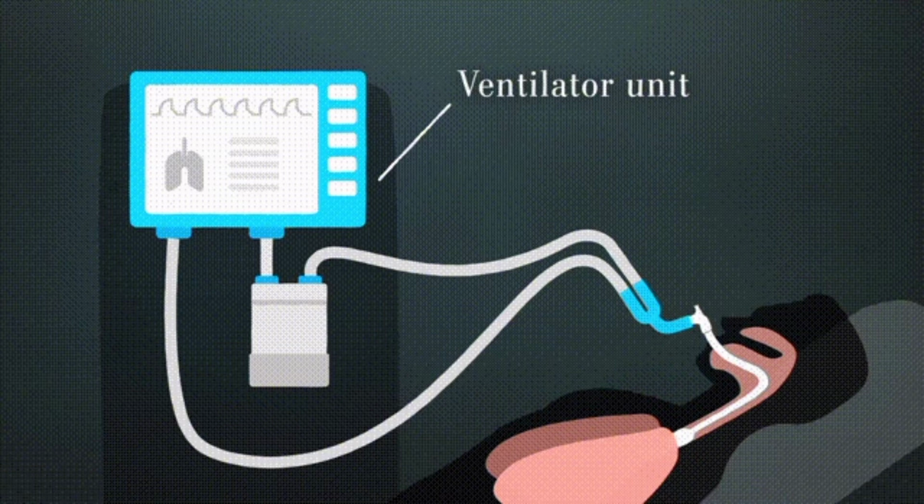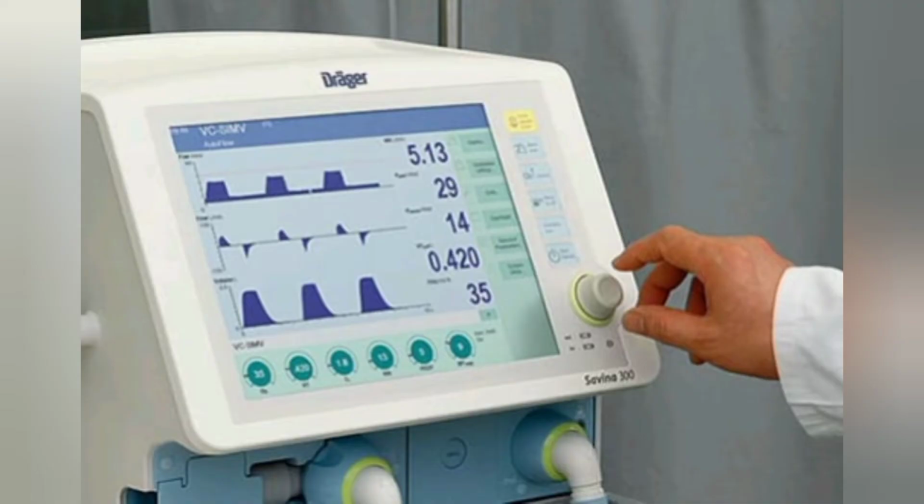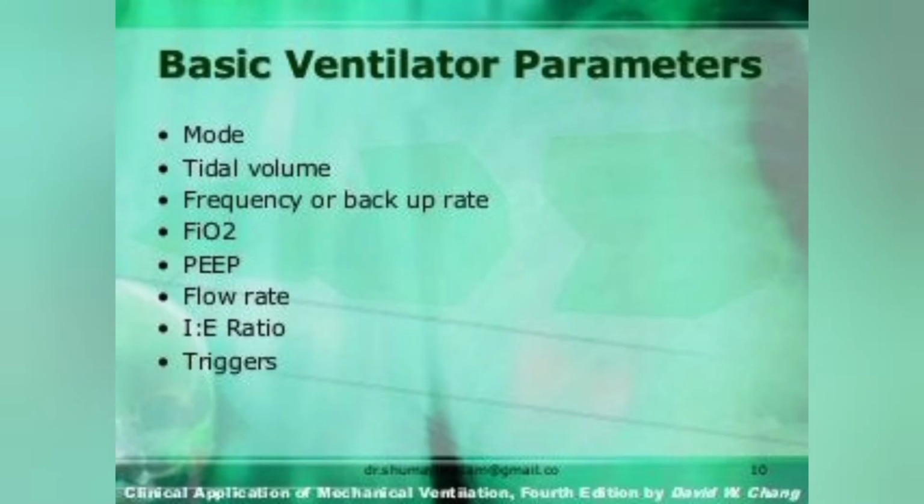Every intensive care patient has different requirements of treatment. According to their medical conditions, the doctor or clinical team decides how the ventilator is used for patients. A ventilator has some specialized modes for different breathing patterns and for the fast recovery of the patient's breathing system. In a ventilator, there are parameters to set the rate according to the patient's condition, age and treatment type. Parameters are tidal volume, RR, PEEP, FiO2 and peak pressure.